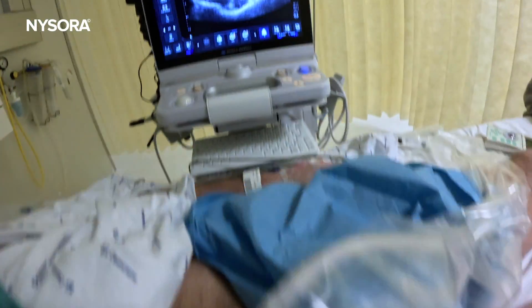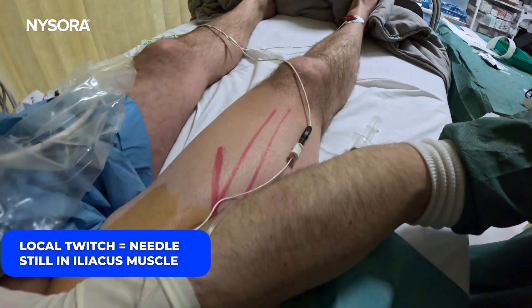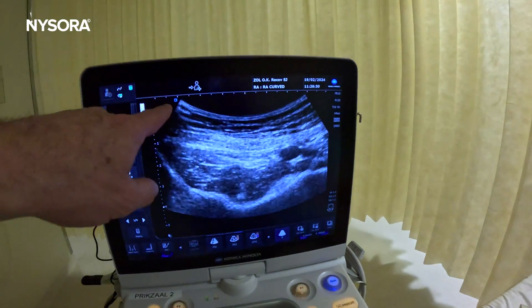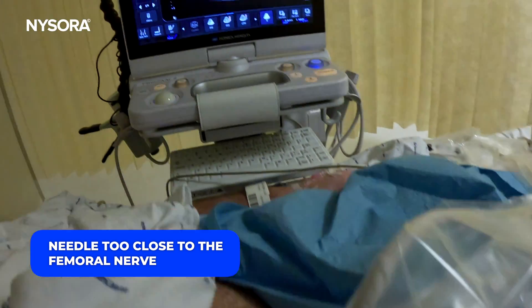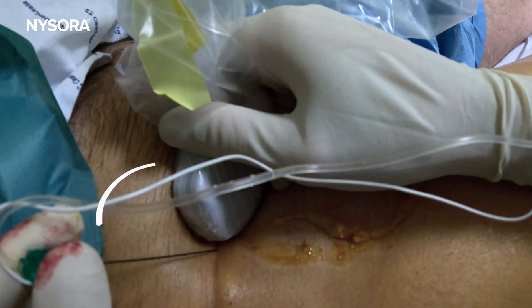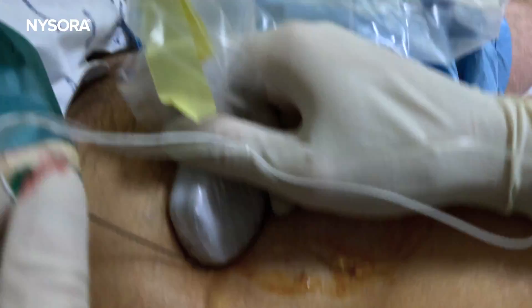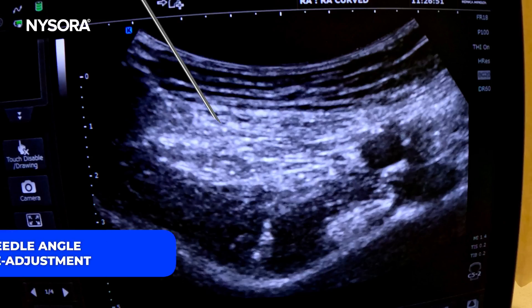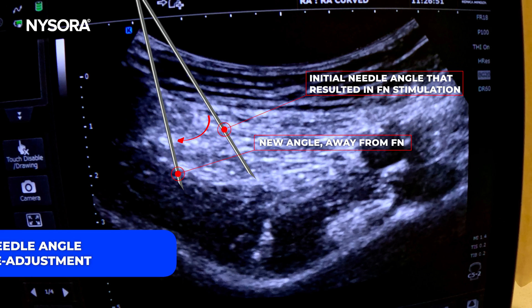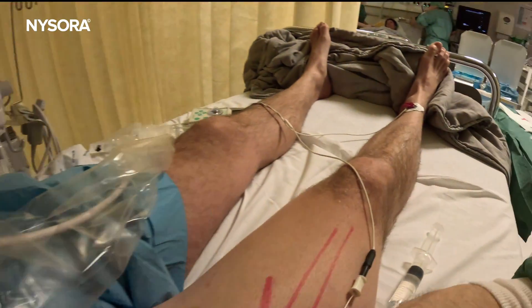We're getting a twitch here, but that twitch is a local twitch of the iliacus muscle — nothing distal. Now we're getting a twitch of the patella, which means that our needle has gone too close to the femoral nerve and requires readjustment. Making the angle slightly steeper — this is proof of how nerve stimulation can be useful as a safety monitoring device. We are now stopped by the bone and the twitch is absent.